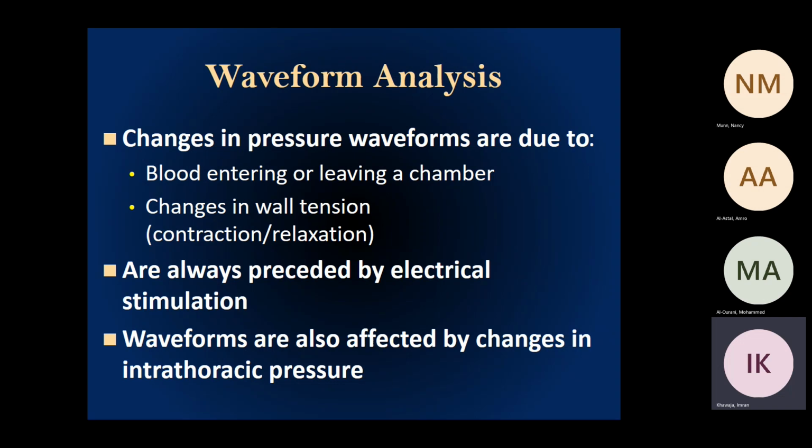And again, we'll discuss that at length. The other thing to keep in mind is that, beside the amount of blood that comes and leaves the cardiac chambers, and beside the status of the cardiac chambers, there are external factors that affect your pressure measurement.